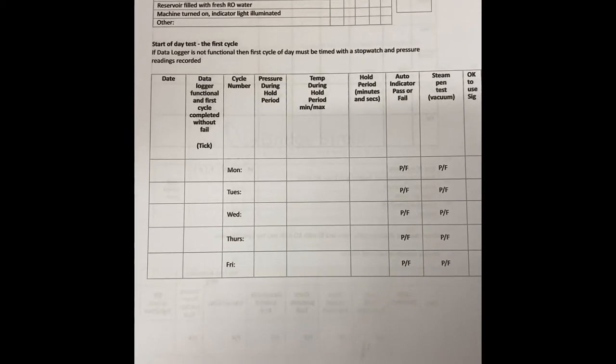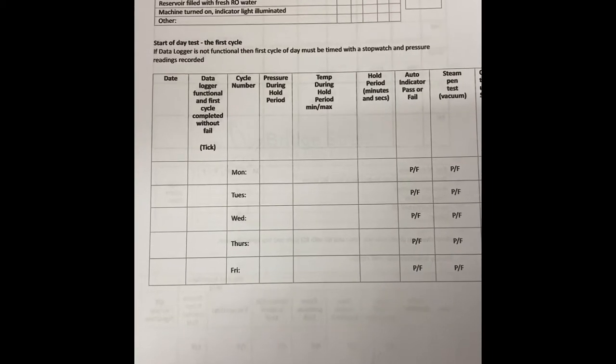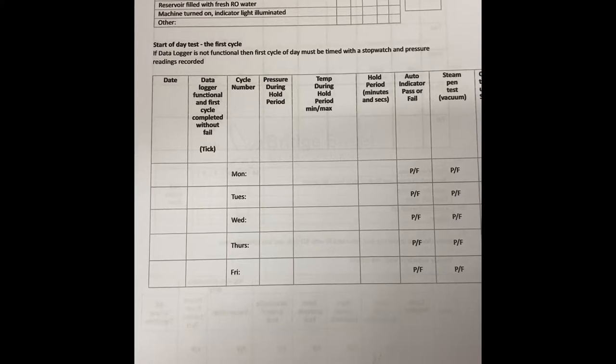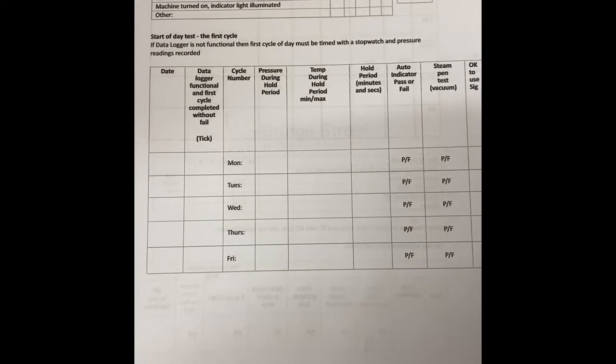We're going to go through some of the daily and weekly autoclave checklists. At the start of the day, we need to tick to say that we've checked the rubber door seal, the chamber and shelves are checked for cleanliness and debris, the reservoirs are filled with fresh RO water, and machines are turned on and their screens are illuminated.